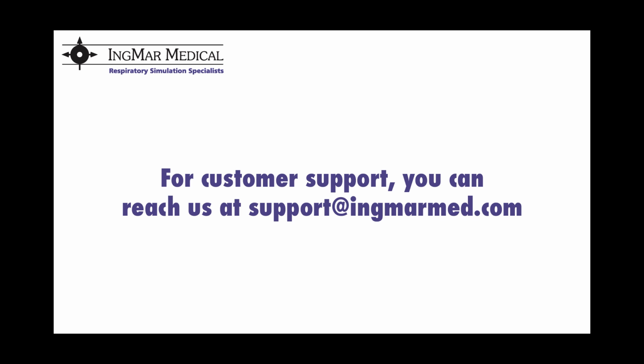We do understand that there is a bit of a learning curve with the system. Unfortunately, that is part of the nature of simulating some of these very complex and sophisticated scenarios. So we are certainly working hard to understand what our customers need and how they can make the best use of our system. And we definitely plan to continue having events like this where we are providing some information to help you get more out of your system.